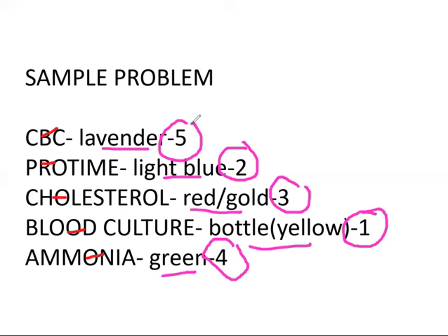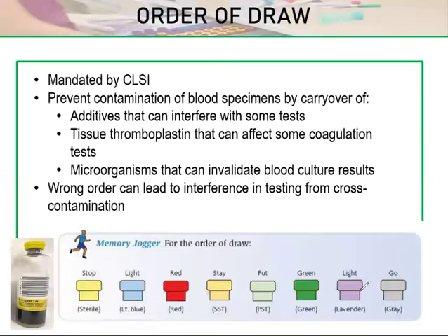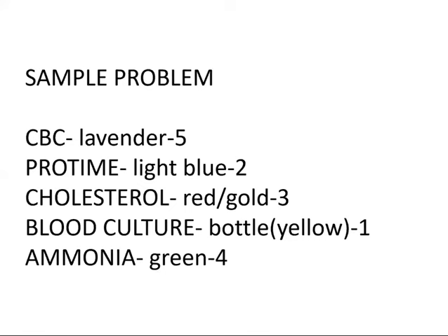decide what the order of draw is that you're going to follow. It doesn't mean, class, that all of the colors must be present for you to follow the order of draw. It's okay to skip some, as long as your order of draw is still proper. So kindly study, read your references, for a better understanding of this topic.